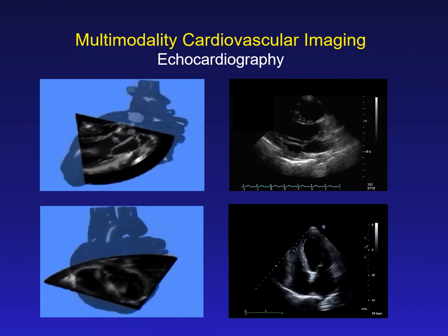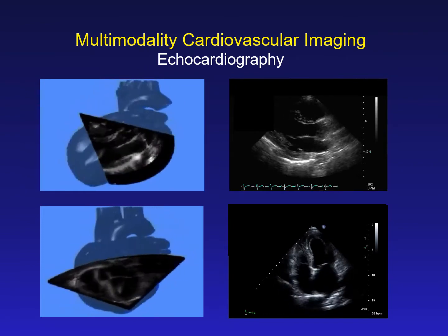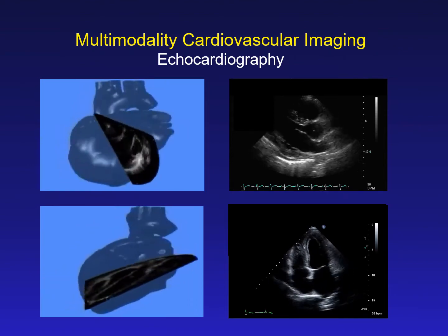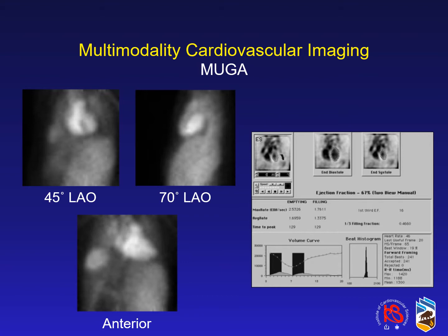With respect to echocardiography, this continues to be the workhorse of imaging in 2020, where non-invasively one can clearly identify the LV systolic diastolic function, whether there are valvular abnormalities in the patient, as well as pericardial disease, all in one limited study. With respect to MUGA scans, they are very useful in the provision of accurate LV ejection fraction values, in particular in individuals that are receiving anthracycline-based chemotherapy in the cardio-oncology realm. However, in the setting of apical cardiomyopathies, MUGA scans have limited use.